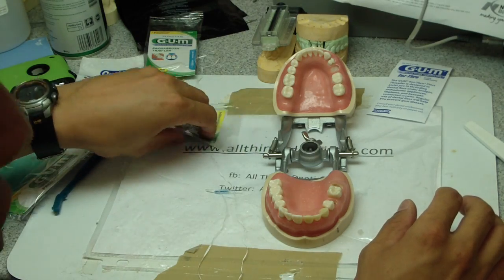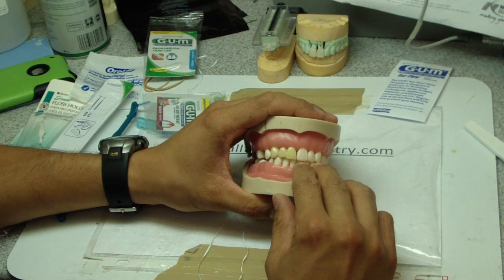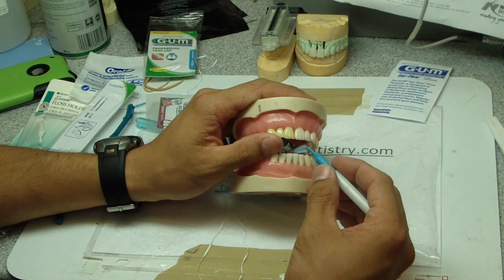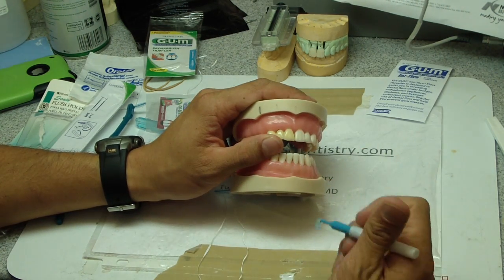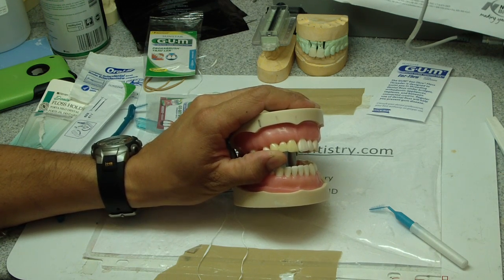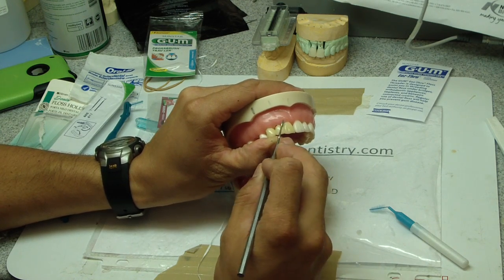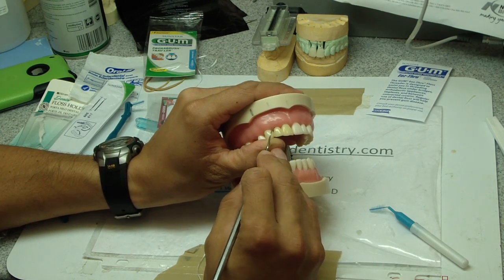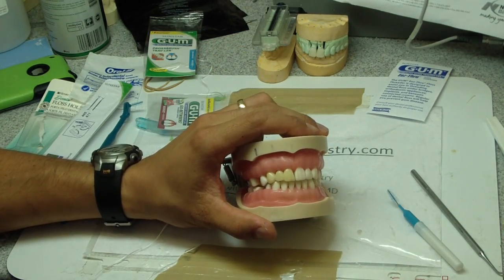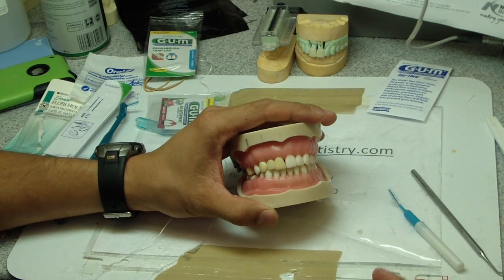I'm going to tell you the secret of maintaining your bridges: keep them clean. That is it. Anything man-made is going to fail, and the longer you can keep it from failing, the better. The most points of failure due to getting a cavity are right where you cannot access with regular floss. So if you can keep that area super clean, you might be able to hold onto your bridge a lot longer. Alright, you know who you are — I got you. I hope that helps. Let me know what you think. Cheers.